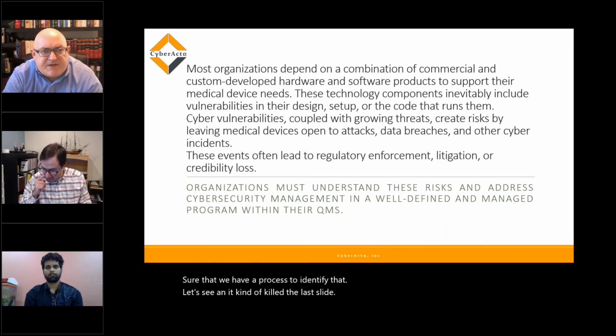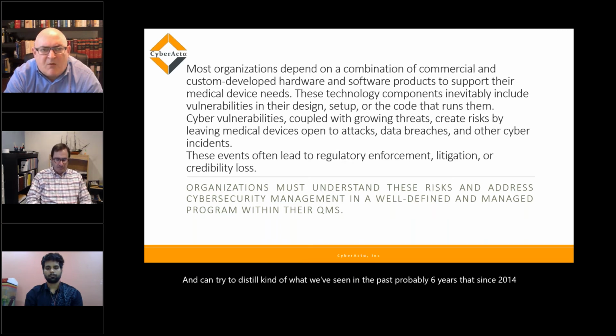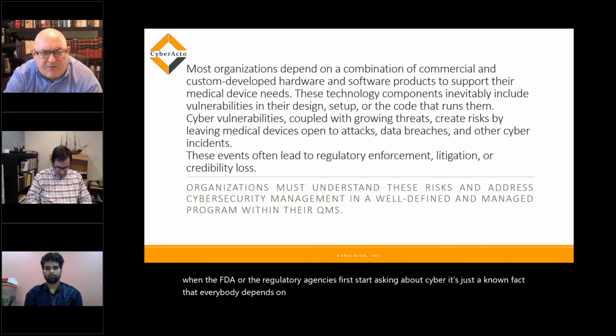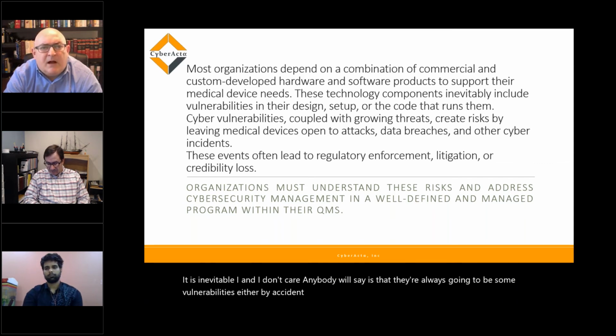and again, trying to distill what we've seen in the past probably 6 years, since 2014 when the FDA or the regulatory agencies first started asking about cyber, it's just a known fact that everybody depends on commercial and custom developed hardware and software for any medical device that runs software. It is inevitable. And I don't care what anybody will say, there are always going to be some vulnerabilities, either by accident, by default, or whatnot.